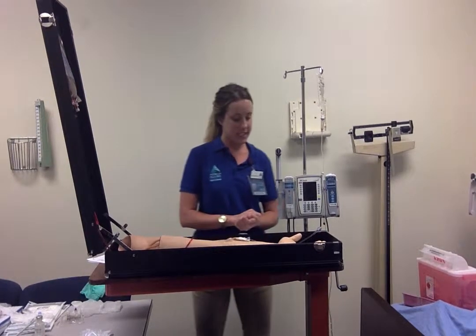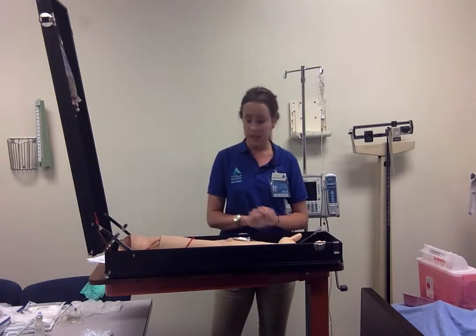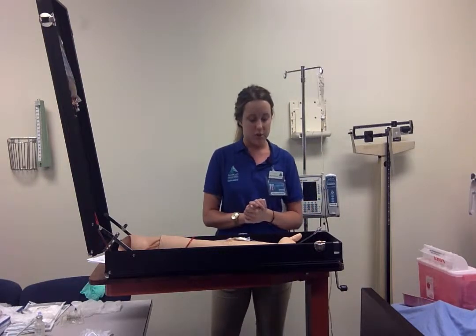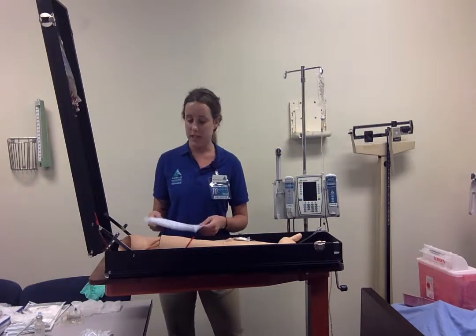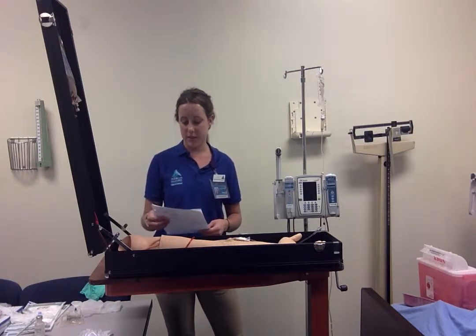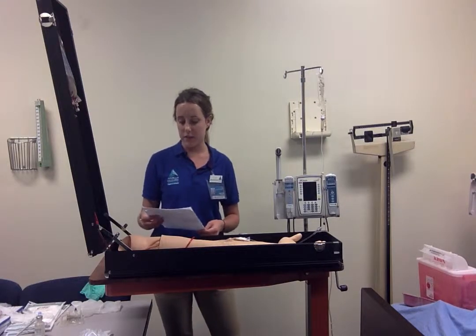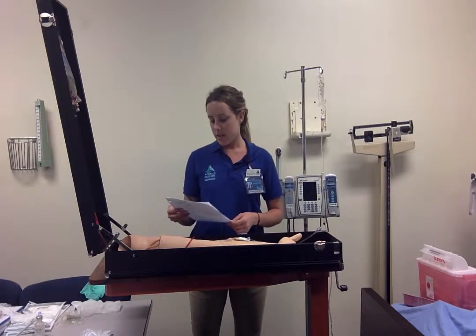I'm going to be doing an IV medication with a piggyback. I'm going to come in and first check the physician's order and verify the correct medication. Make sure there are no allergies. We're going to be administering Rocephin, 1 gram IV daily as directed over 30 minutes.